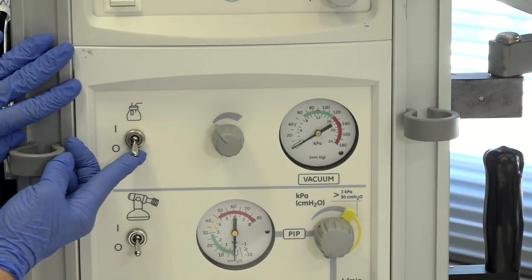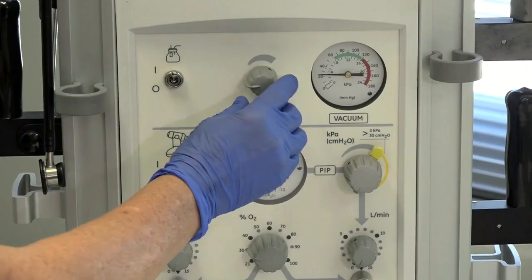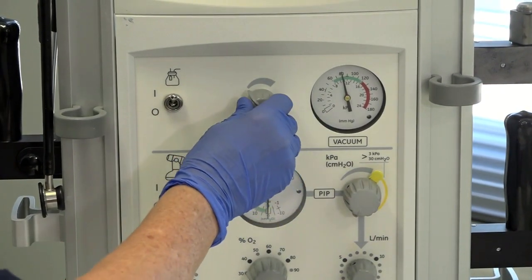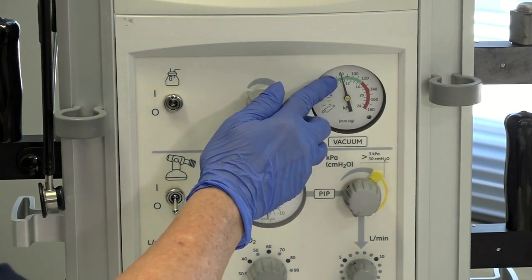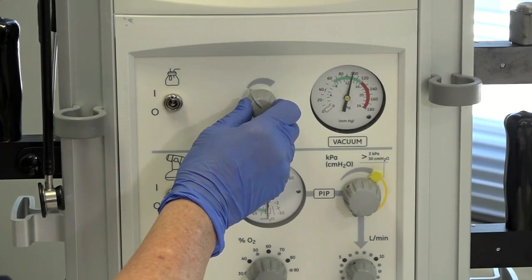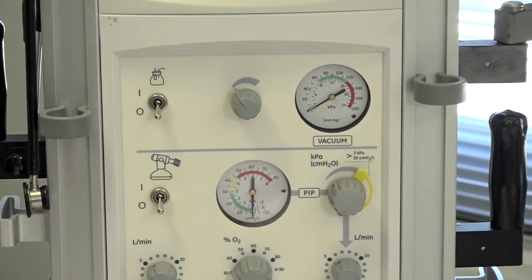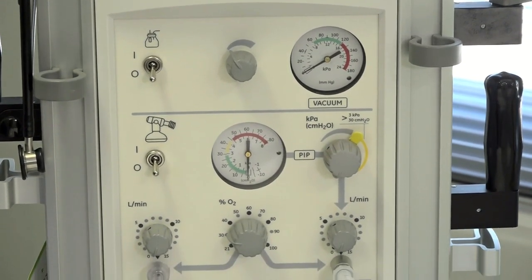We turn the suction on by switching the toggle switch on and we'll occlude the tubing. We'll then use the suction dial and rotate it clockwise to adjust the pressure. A small baby, say less than 1500 grams, wouldn't require much more than 80 millimetres of mercury. Our larger baby, no more than 100 millimetres of mercury. If we leave that on and then turn the toggle switch off, it will remember our settings — so we turn it off so that we don't use too much gas during the resuscitation. All it requires is a flick of the lever and we're ready to go.